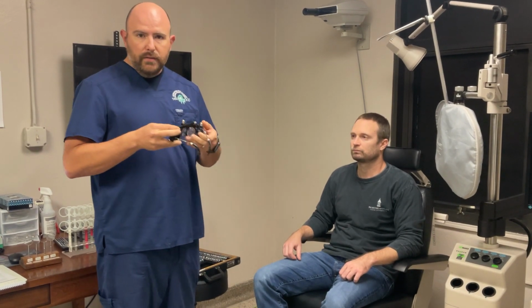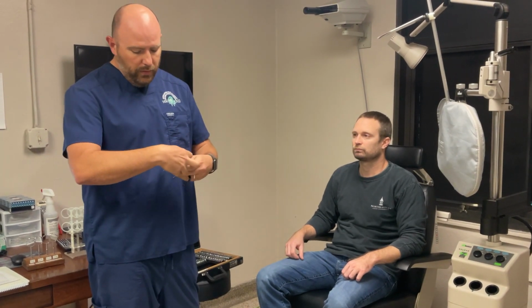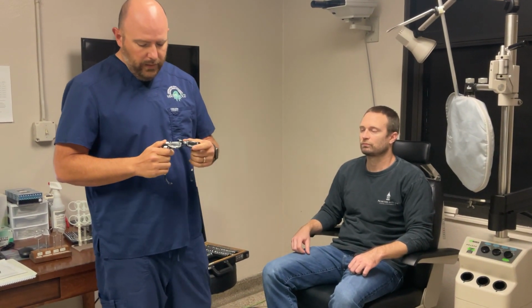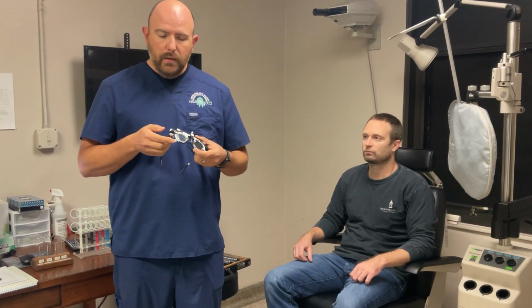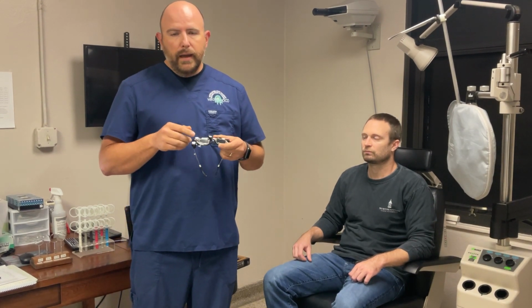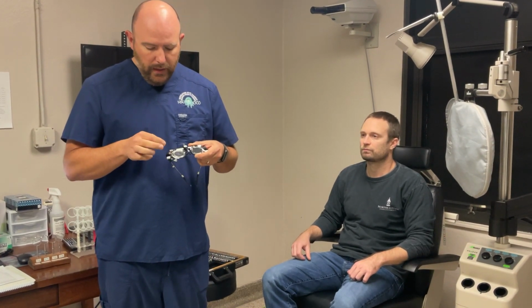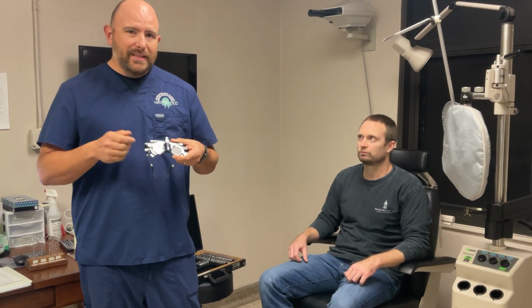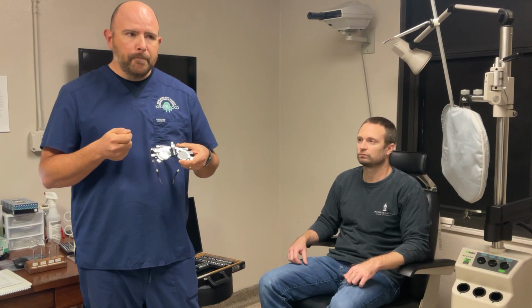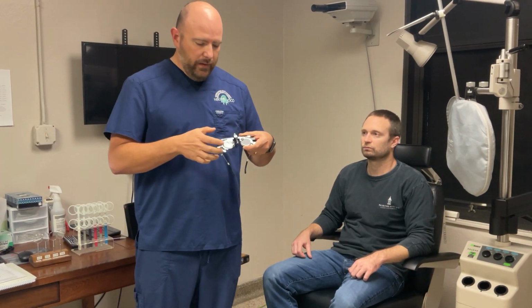Now, one of the things that you need to note whenever you're conducting a trial frame proficiency is the placement of the lenses. For the proficiency, you should place them correctly and in the correct wells. So for instance, the sphere should go in the back well. The cylinders should go in the front well. And a little tip, as I've mentioned in class before, is I recommend placing the handle against the stop on the front of the trial frame, just so that it's easy to change out. If you have to change your cylindrical lenses, it's very easy to swap them out without having to modify where the axis is every single time.